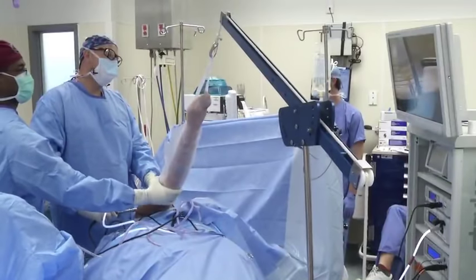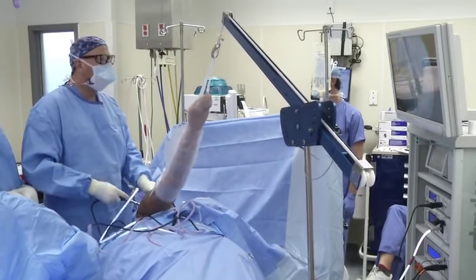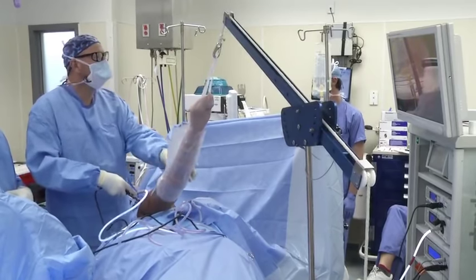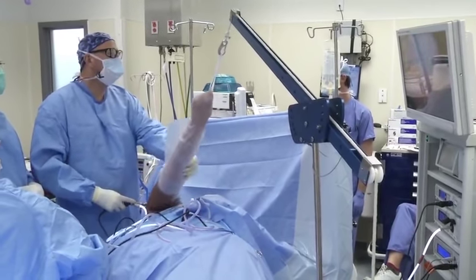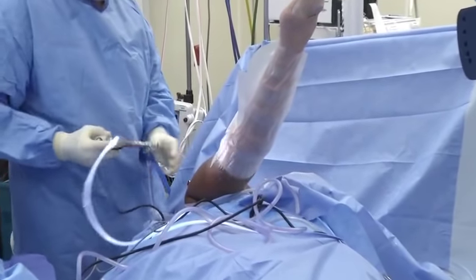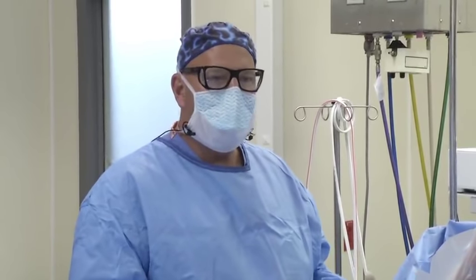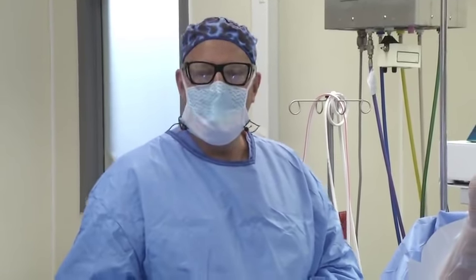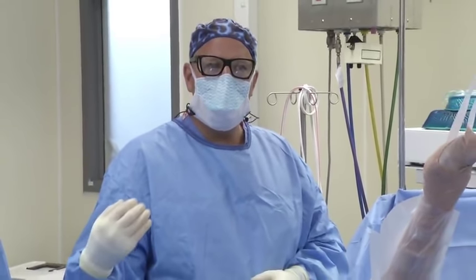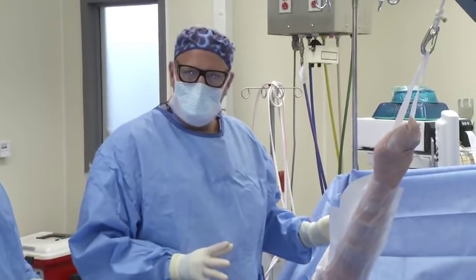Now we're going to rotate the arm, and you can see we have no restriction in motion, plenty of room up top. And hopefully we'll be able to maintain this motion in the postoperative period. So a frozen shoulder is a very painful condition because the shoulder is sore, painful, and stiff. As in this particular patient, oftentimes they've had previous surgery. It's typically associated in individuals who have diabetes. That's one of our big concerns, and her sugars are a little bit high.